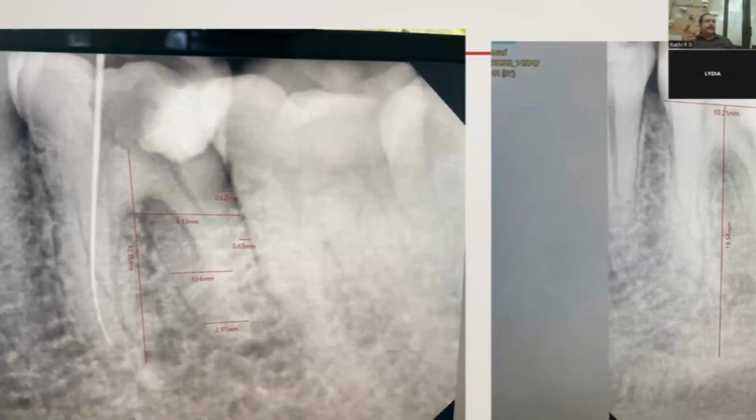If you're having a millimeter of space spared for metal and a millimeter spared for ceramic on the prosthesis side, you can make it a full metal crown, which wouldn't require that much space compared to a metal ceramic crown.